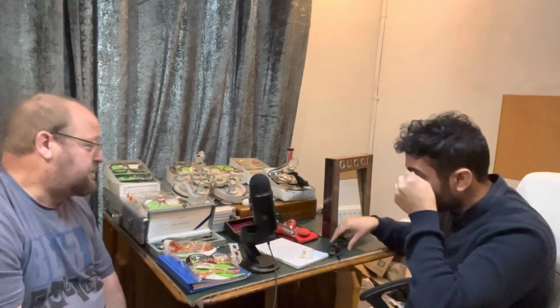Satin black. You'll notice on the side, when you look on the back of the side, it's got a little bit of stainless steel. That's actually a rivet plate because the joint itself is riveted to the side. Right. They're great. You'd easily get a bifocal in there, wouldn't you? Easily. Okay. Lovely. Alright, the next one.